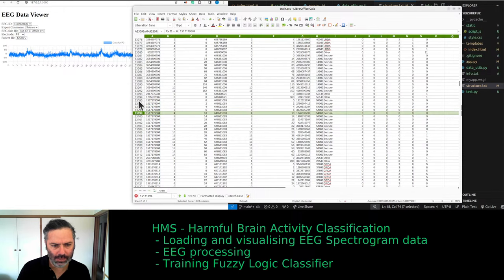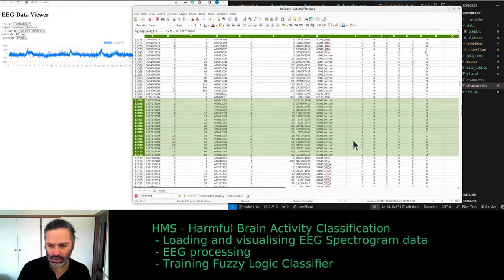But with the same data segment, this 604 at the end, you also have a couple of epochs, 50 second segments that were labeled by 5 experts. So I'm not sure why the whole 5 just didn't look at the whole thing. Again, this would be a 62-second segment. I don't know why. It's essentially, the overlap is very heavy. I don't know why.